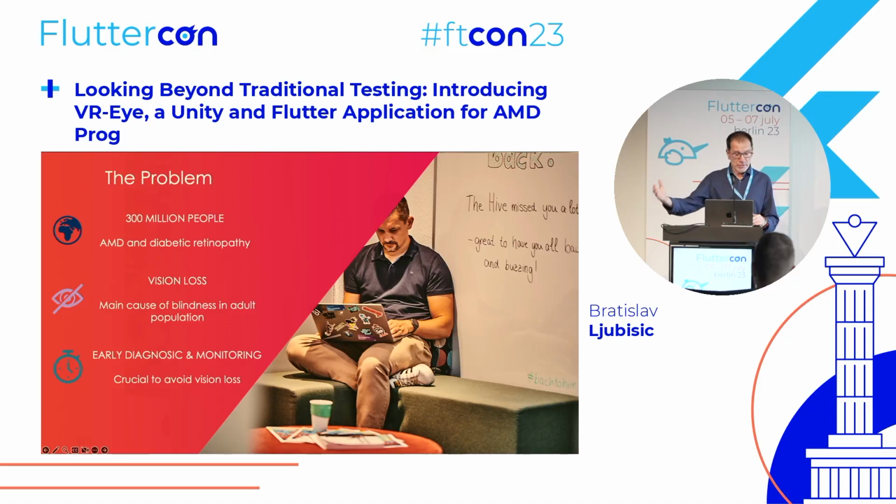As I already said, the main cause of blindness in the adult population, in elderly people, is AMD and diabetic retinopathy. Early diagnosis and monitoring are crucial to avoid vision loss in such patients. We took a look at the technical landscape on the market today.